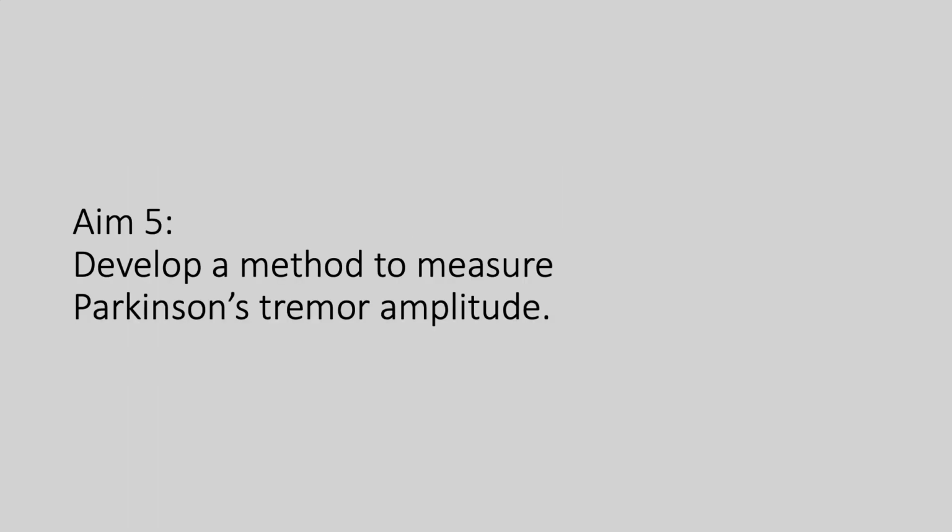Finally, the development of the tremor amplitude measurement method began. This built upon the prototype, also being written in Python. Blob detection was replaced with hand detection, implemented using MediaPipe.